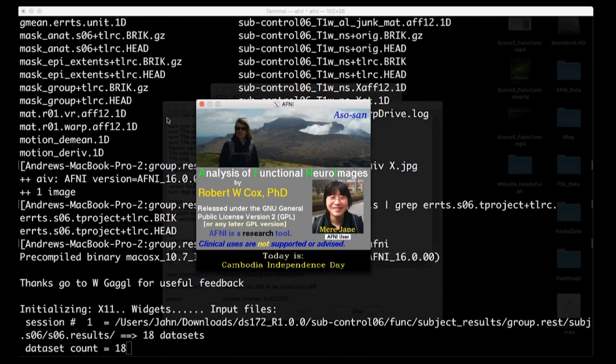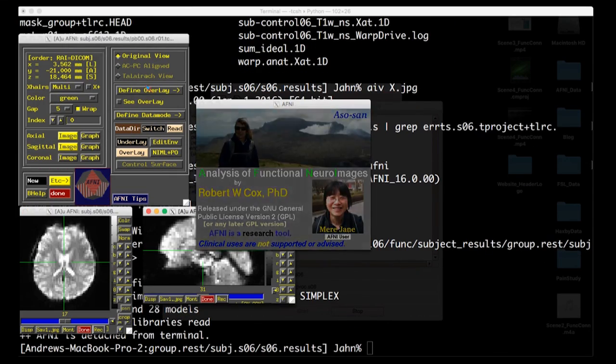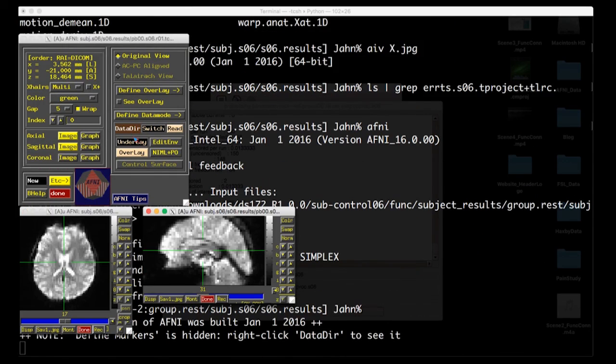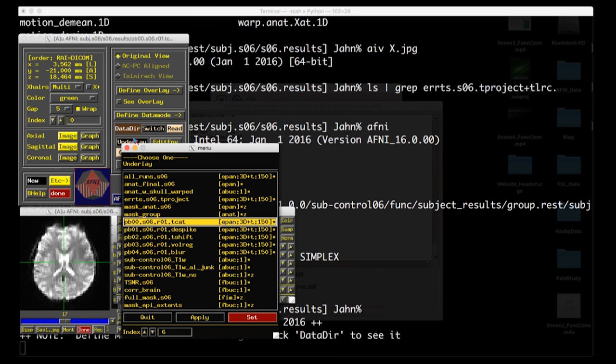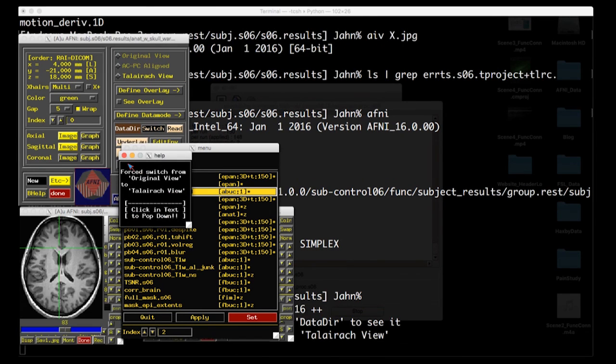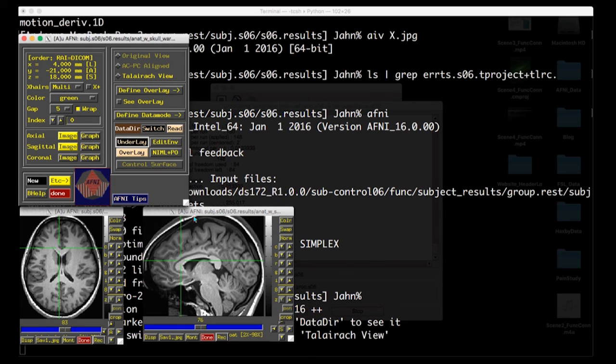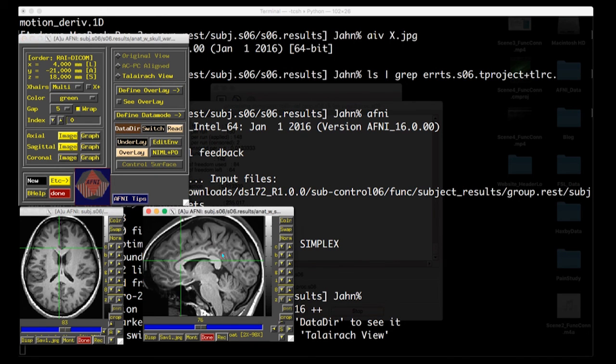Where you need to kind of flip it around your mind is that with resting state data analysis, the error time series is what we're interested in, and what we're going to be using for correlation because that is what has everything filtered out of it.